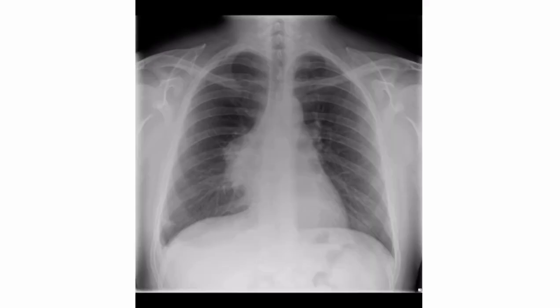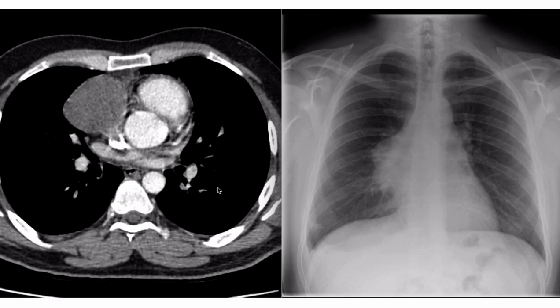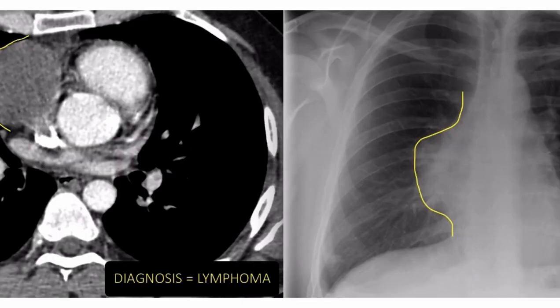On this chest X-ray we can see the silhouette of the hilar vessels, but the right heart border is obscured, so the mass is in the anterior mediastinum. This was confirmed on the CT, and the diagnosis is lymphoma.